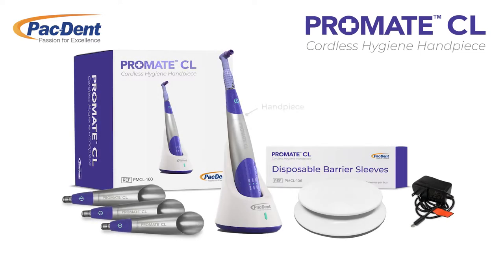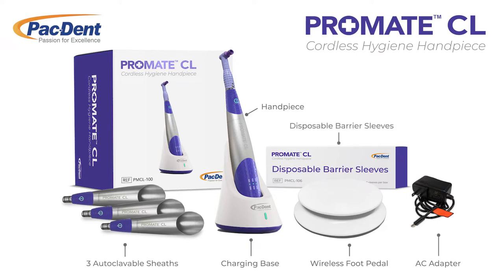The ProMate CL includes a well-balanced handpiece, a charging base with inductive charging, a wireless foot pedal, an AC adapter, three autoclavable sheaths, and disposable barrier sleeves for effective infection control.